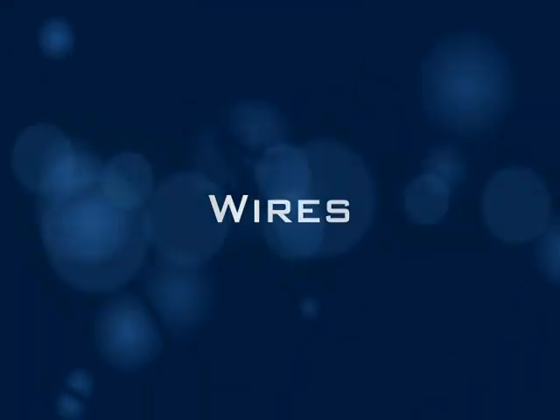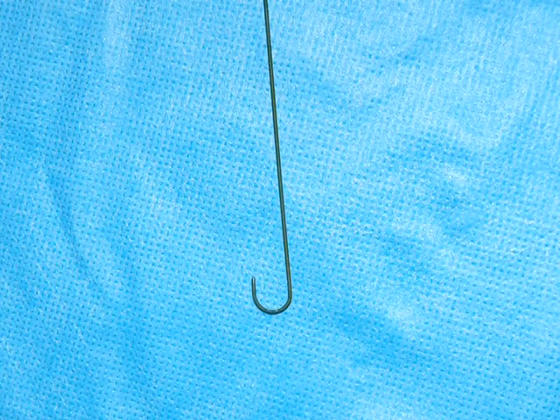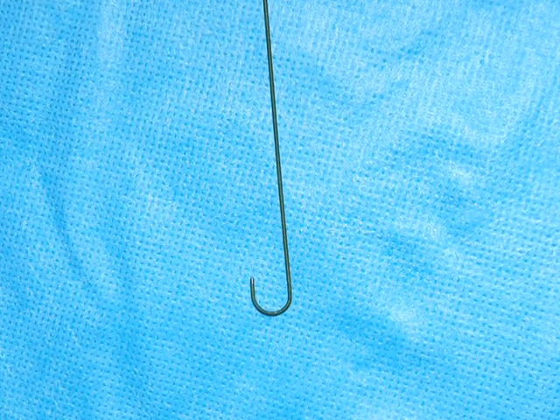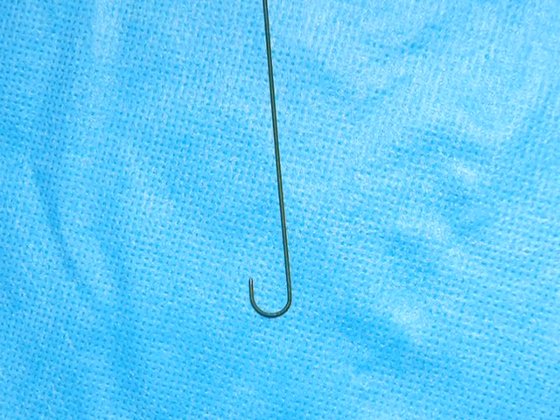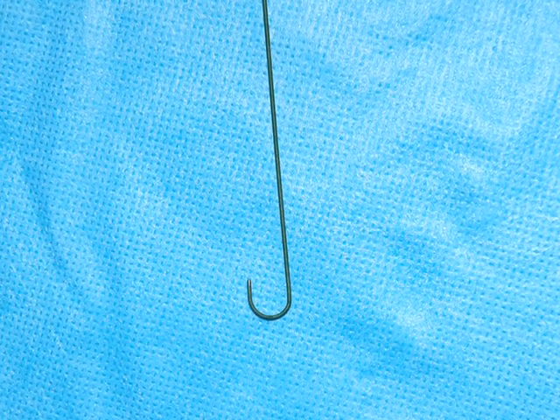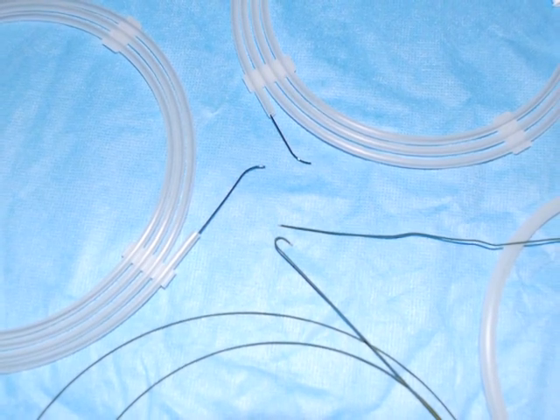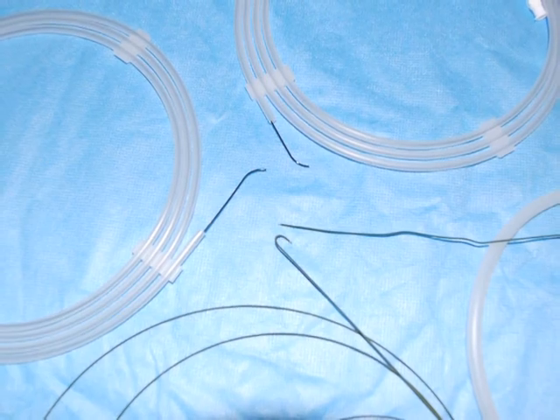Guide wires are spring-coiled, soft safety guide wires with tips that can be flexed and are introduced either through the access needle, through the sheath, or through catheters, and are used to advance catheters and sheaths, and also to exchange catheters and sheaths once vascular access has been obtained. These wires vary in diameter, in consistency, in weight, in strength, and are designed for specific applications.